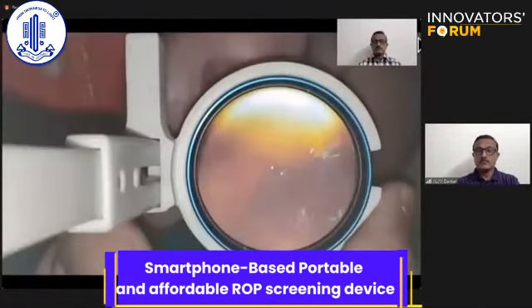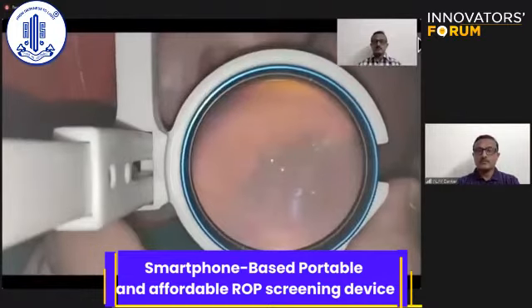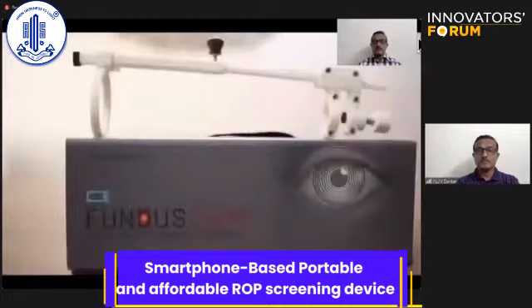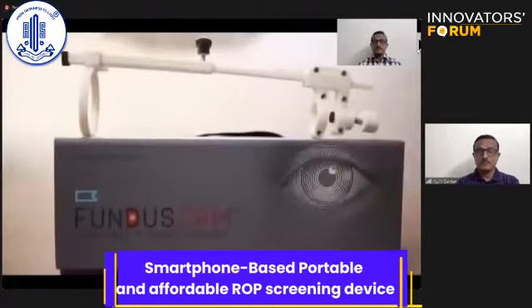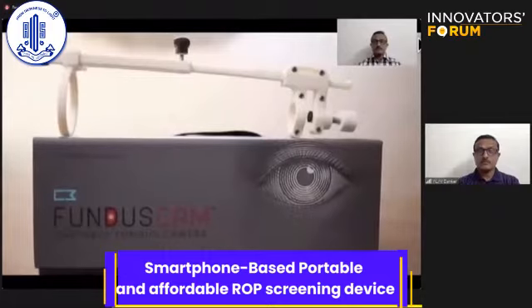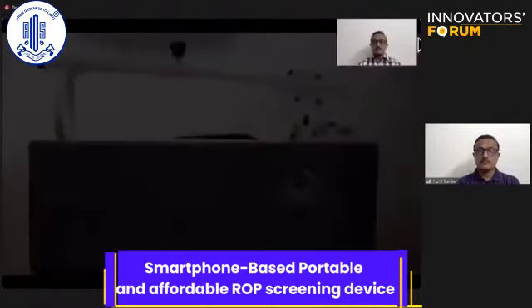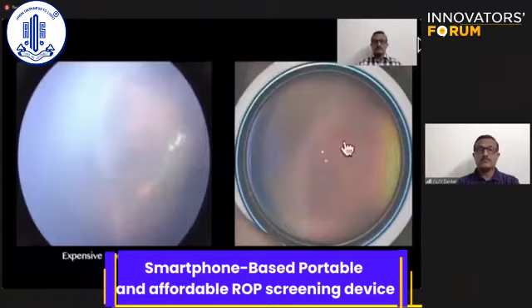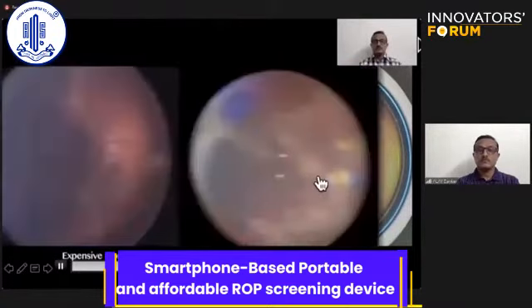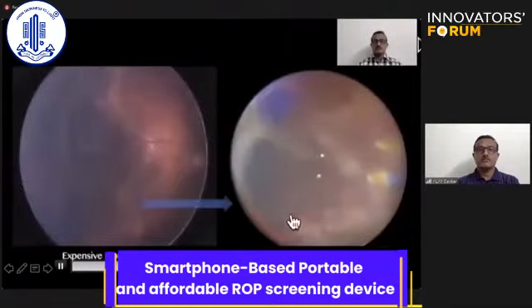These are the actual recordings taken from the smartphone during our screening. The result is high-quality images for diagnosis extracted from videos, which are comparable to currently available contact ROP screening devices. Image showing magnified view of stage 3 threshold disease. Similar comparative image showing laser marks and peripheral TRD.